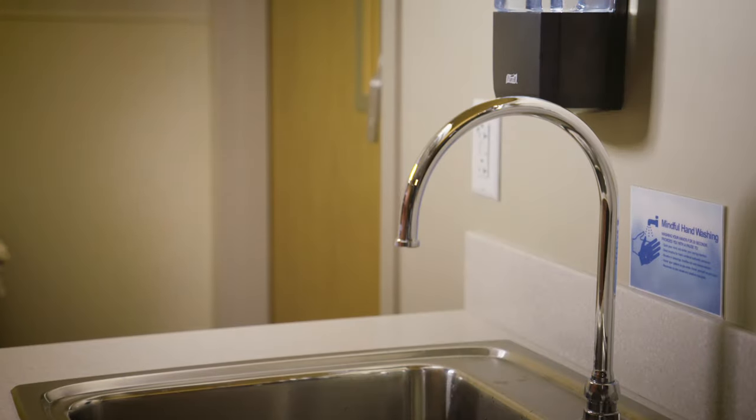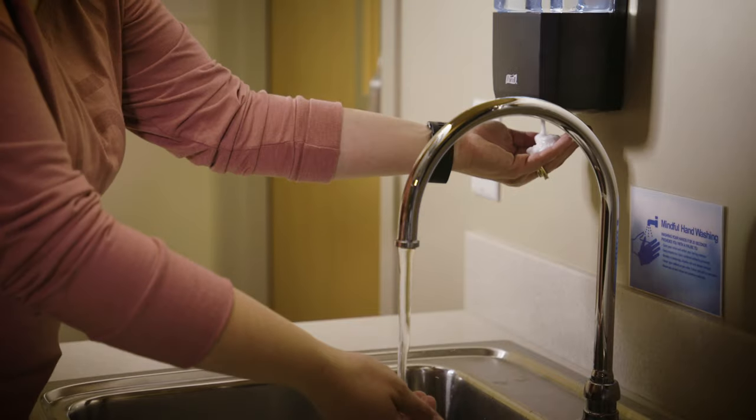Before you start, wash your hands thoroughly with soap and warm water. Put on non-sterile gloves. Now you're ready to get started.